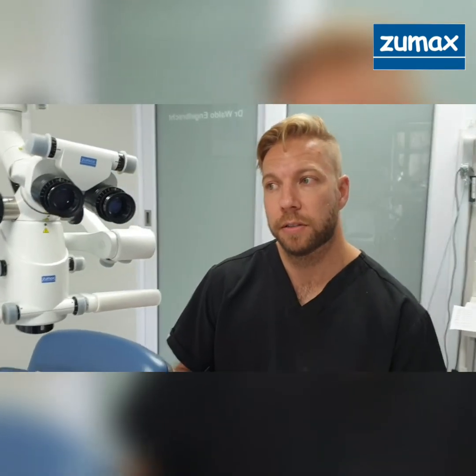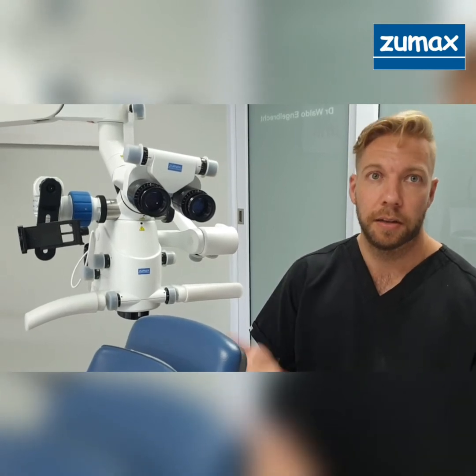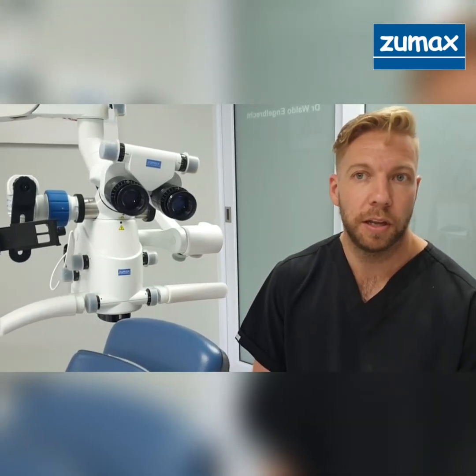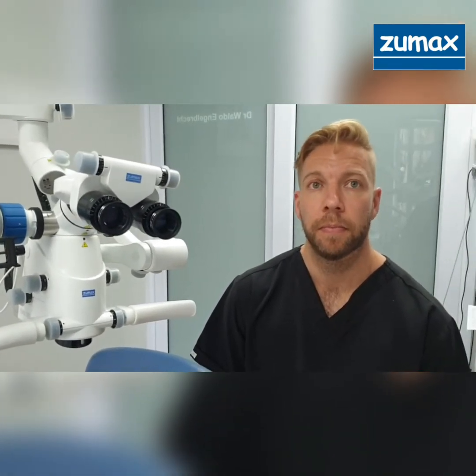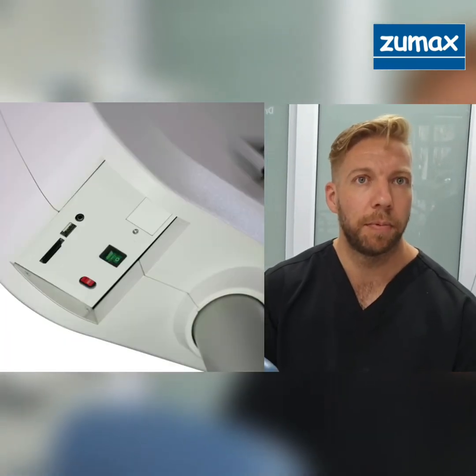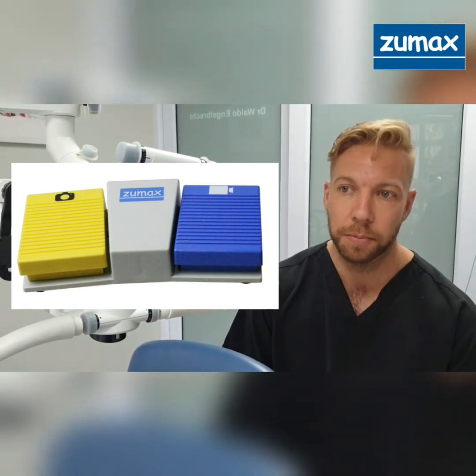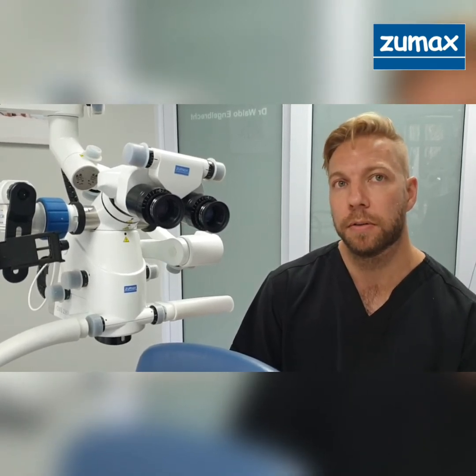What's nice about that is when I do some surgery, I stand and I can get the microscope right up and far away from the patient and still be in focus, still working through the microscope. And with documentation, you use your cell phone adapter and you also use the built-in SD card. I find the built-in SD card definitely worth it because you can just step on a pedal and you don't have to press an extra button. Sometimes you use the cell phone, but I mainly use the built-in SD card.